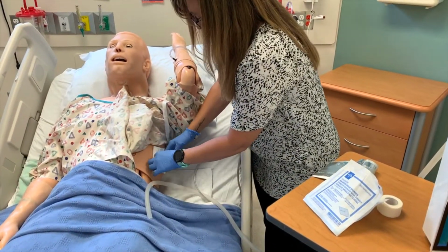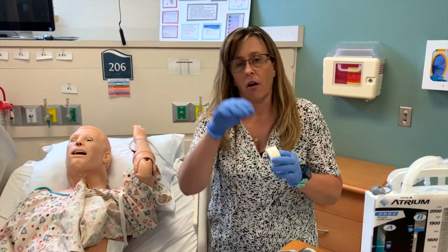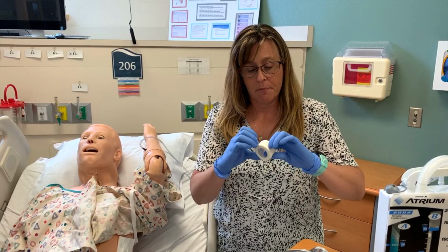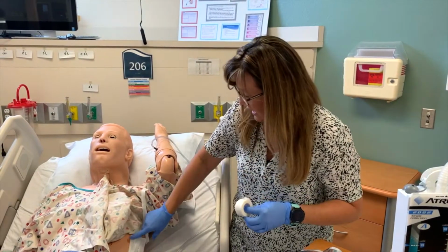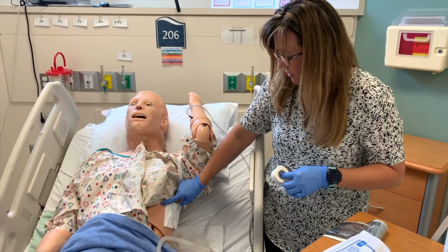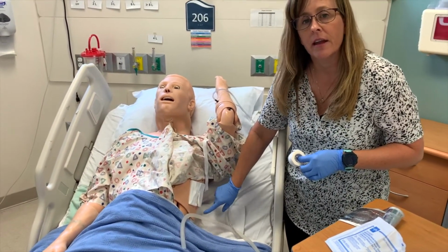And then what you'll do is you're going to make sure that you tape it. You're not going to tape it on all 4 sides. No, don't tape it on all 4 sides. You're going to tape it on 3 sides with the tape not being connected at the bottom. So you're going to tape here, you're going to tape at the top, and you're going to tape at the other side, never at the bottom.